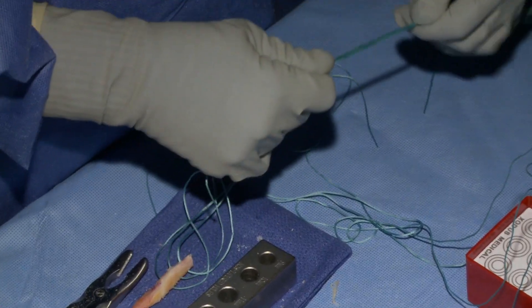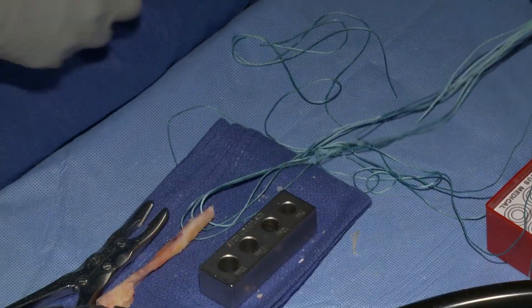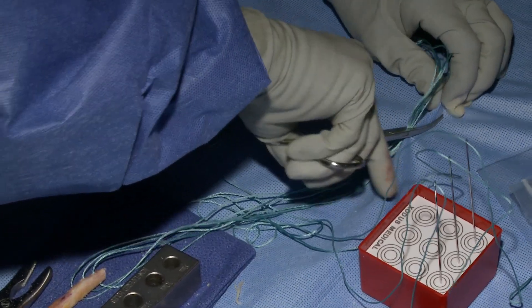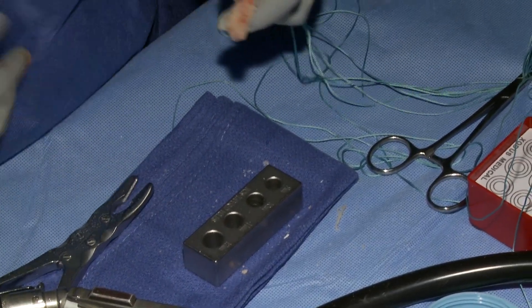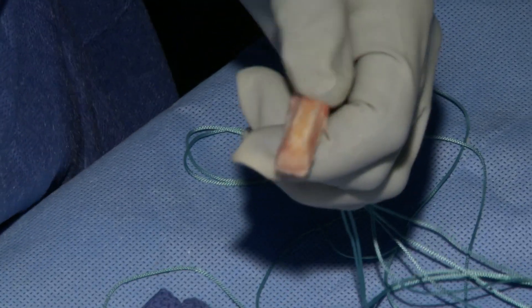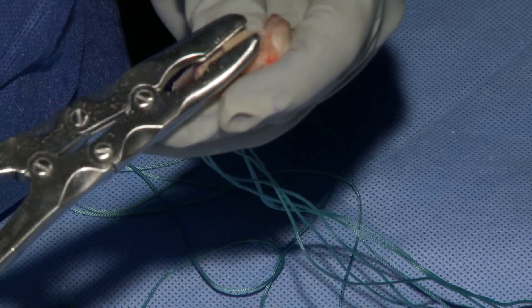Once the patellar plug is finished, I always make sure that I clamp the Ethibond sutures to the drapes so that the graft is secured. Sometimes it gets a little slippery — if I'm using the saw I want to make sure that it's not going to fall.